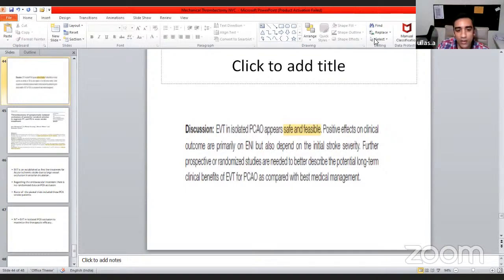And also, if you see the post-procedural CT or the MRI, you would see that the stroke is limited to the areas which were seen earlier. So that definitely saves that much amount of brain, which itself would have a positive effect for a longer term. So recognition is very important in posterior cerebral artery stroke.